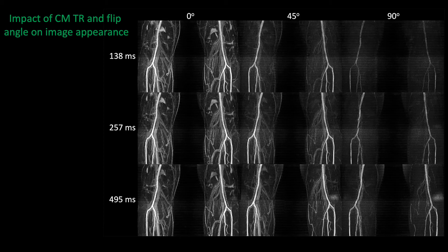Here's an illustration of the impact of sequence parameters such as TR and flip angle on image appearance. With a very long TR of about half a second, we have too much signal from background tissue such as synovial fluid and superficial veins. Whereas if we use too large a flip angle — 90 degrees for instance — we suppress everything, which is of no use. The best compromise is a short TR of about 138 milliseconds with a flip angle of 45 degrees, in which case we see the arteries quite nicely but suppress the background tissues and veins.